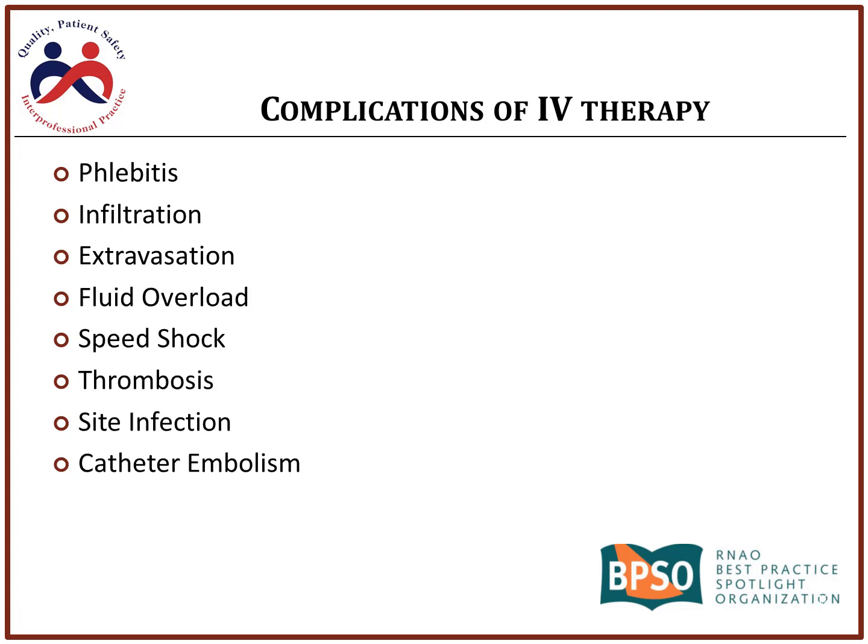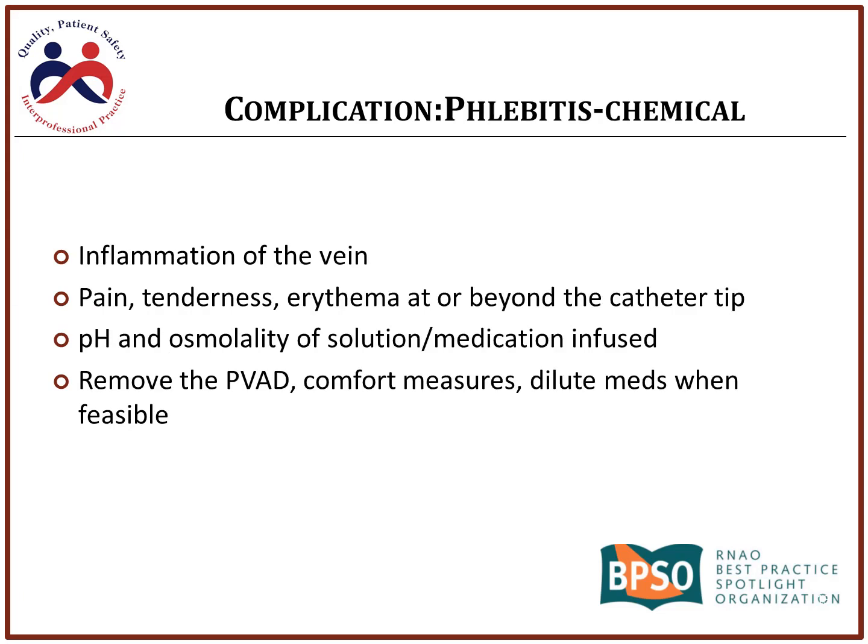Complications of IV therapy, there's lots of them. Phlebitis, you can have infiltration. The fluid can go into the skin. Fluid overload, when you have a patient who's maybe a CHF patient who's at risk for that. We're giving them too much fluid. We're going to get the crackles when we auscultate. Speed shock, if we're giving something, a foreign body, and we're giving it too fast, we can create this reaction in the body, speed shock. The site can become infected, and we could also have an embolism. So there's lots of different complications that could happen.